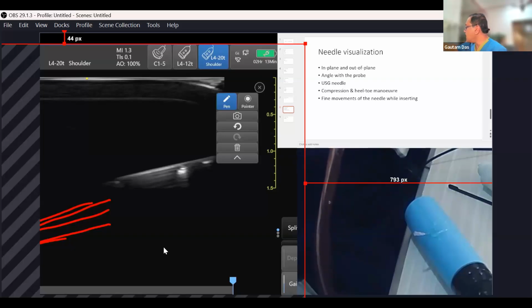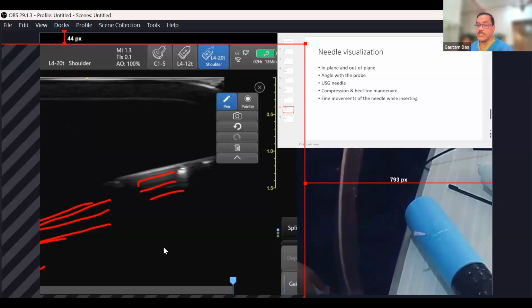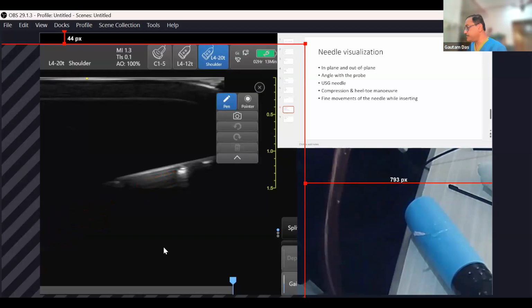So this ultrasound, which is reflecting up and down and then going back, reaches the probe later. So the machine will think as if this beam is coming from deeper structures. The machine will convert this into an image and you'll see several lines below that. That is what reverberation is. Okay, so is reverberation clear to everybody?